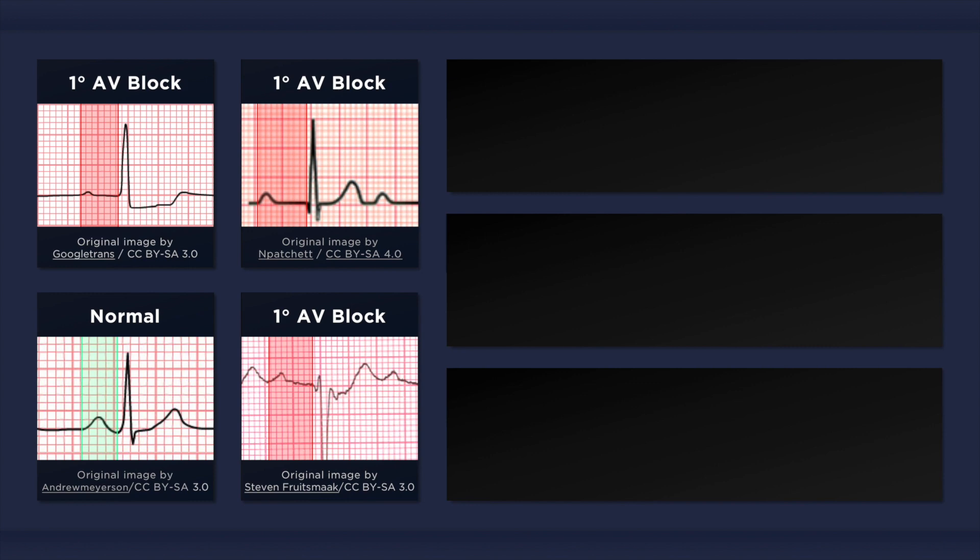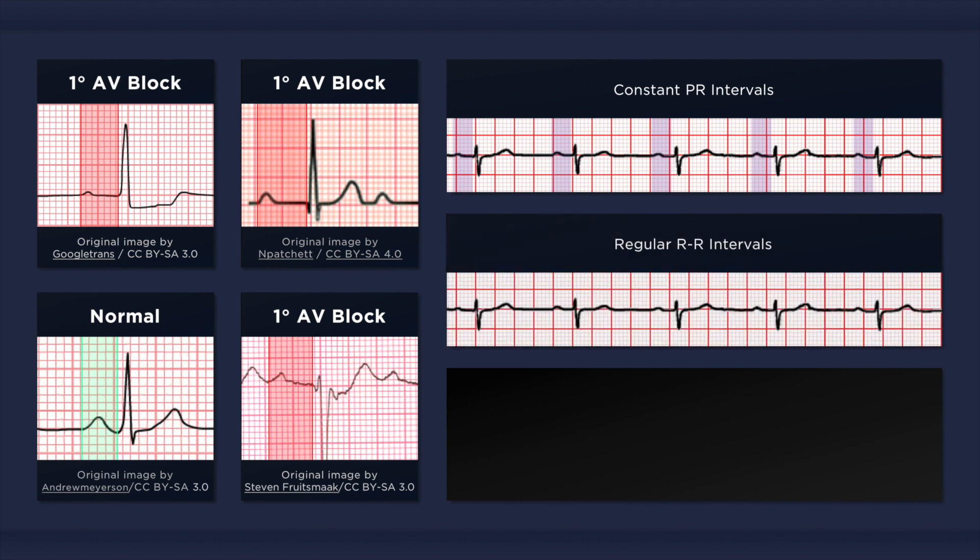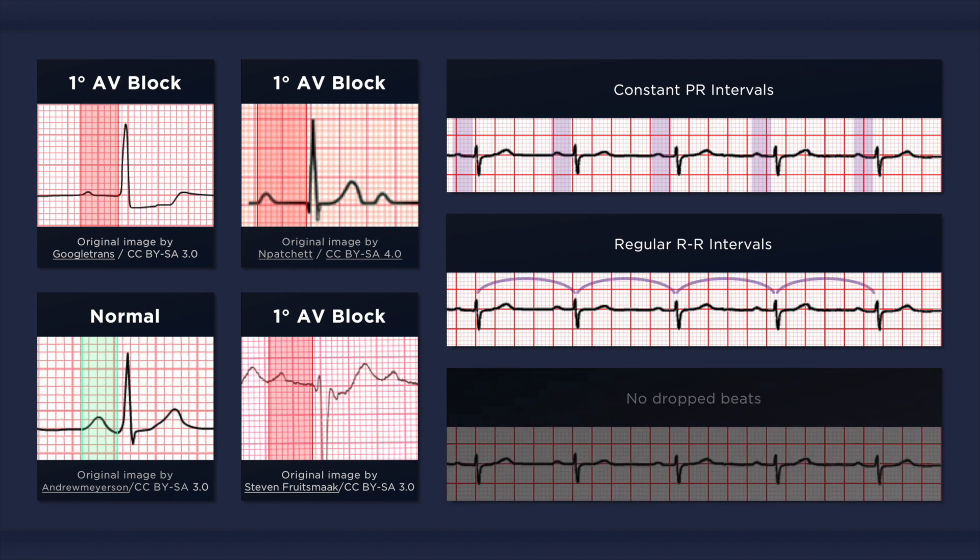Now there are a few more features of first degree AV block which are worth paying attention to. While the PR interval is prolonged, it does not vary from beat to beat. Lengthening of successive PR intervals followed by a drop beat would be indicative of type 1 second degree AV block. The heart rate is dependent on the underlying sinus rhythm and is not usually affected if first degree heart block is the only abnormality present. The RR intervals are consistent and the atrial ventricular rates are equal.